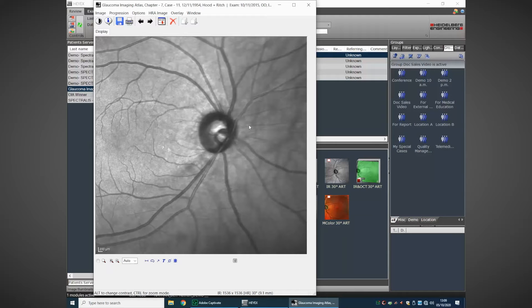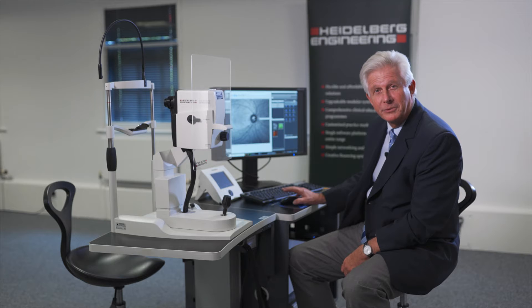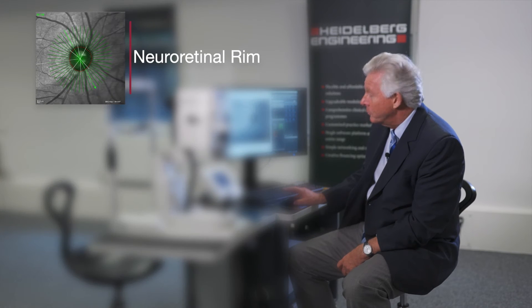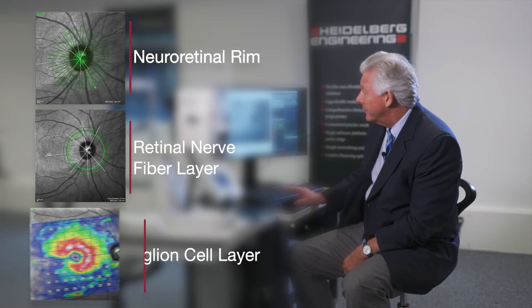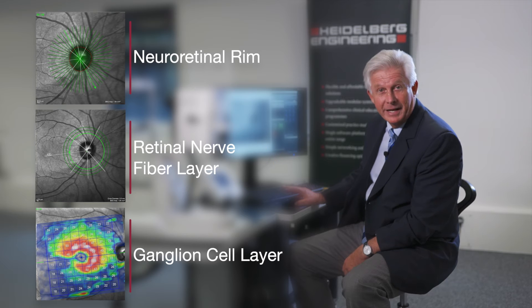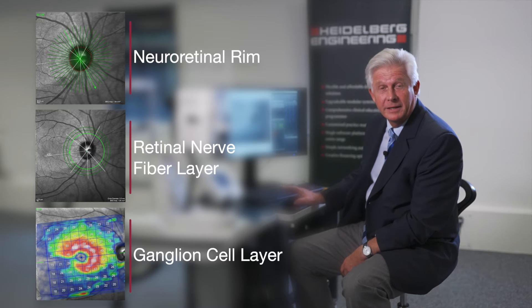We take a holistic approach to glaucoma every time: step one is the neuroretinal rim, step two is the peripapillary nerve fibre layer, and finally we follow the axons around and look at the ganglion cell layer for any notching across the horizontal midline, which is where we typically see changes relative to glaucoma.